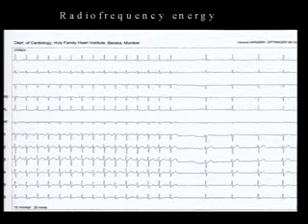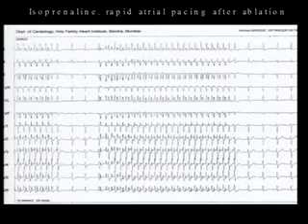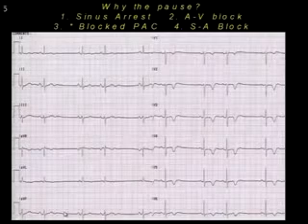Next slide. And after ablation, this is just a slide to show we gave isoprenaline, we did very rapid pacing, we couldn't induce any tachycardia, and she was cured. Next slide. No, go to the presentation. Stay on the presentation.